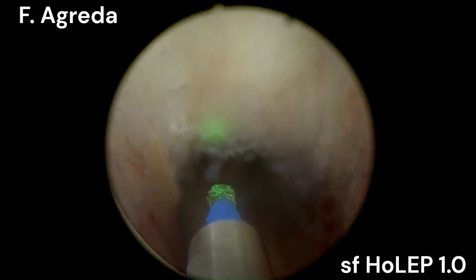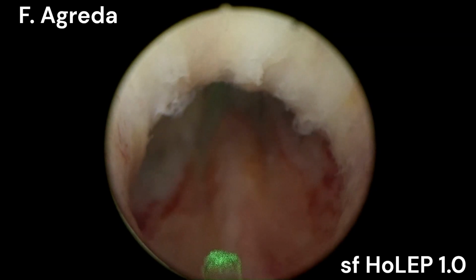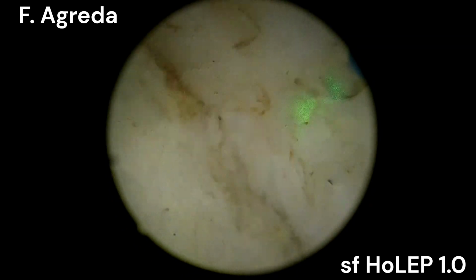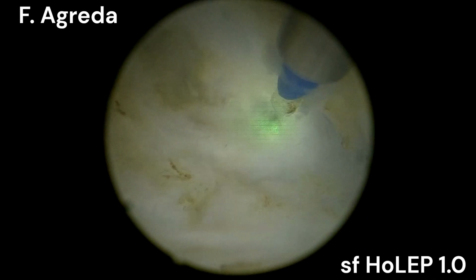So in this first 7 to 8 minutes, we have released the sphincteric mucosa and external sphincter from any kind of obstruction that we could make with our dissection, with our progression of the dissection of the adenoma.